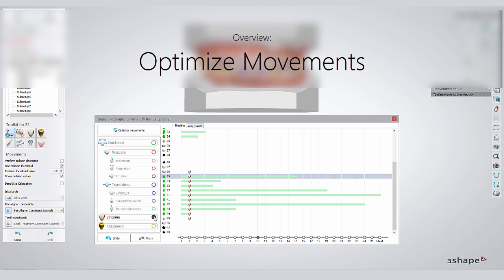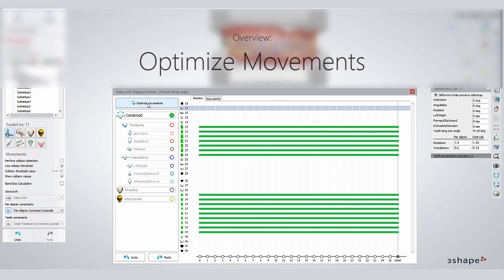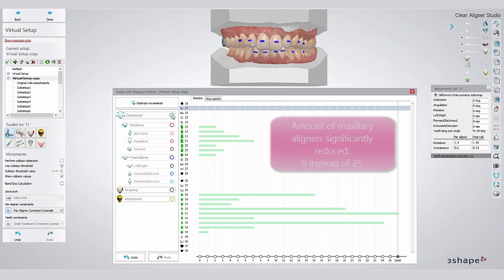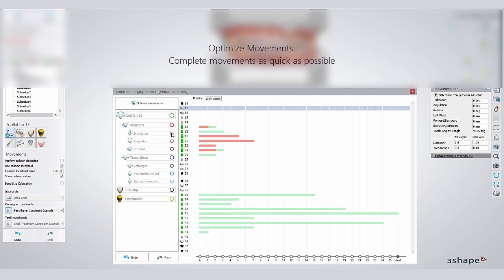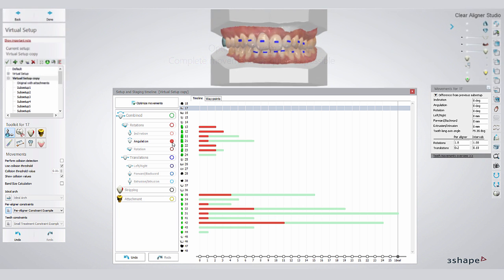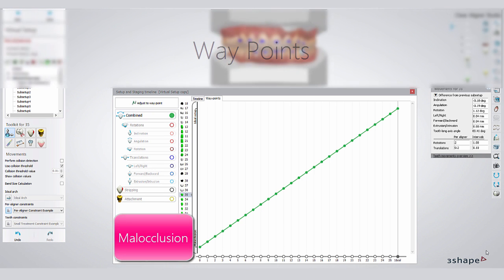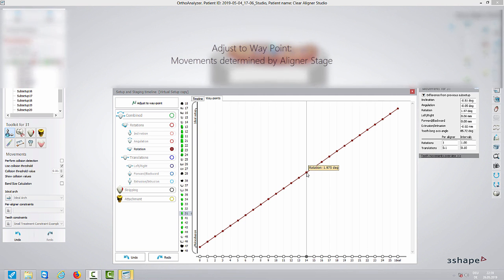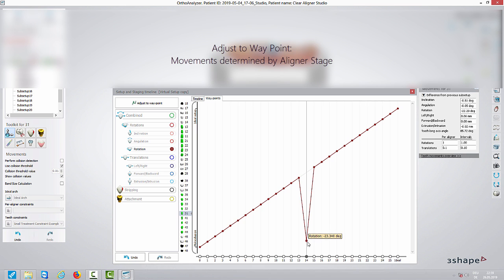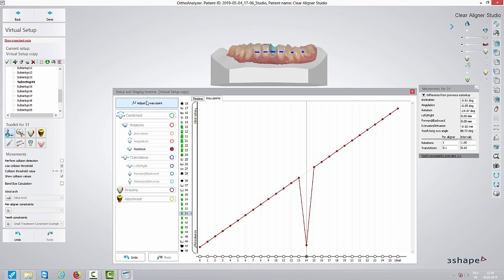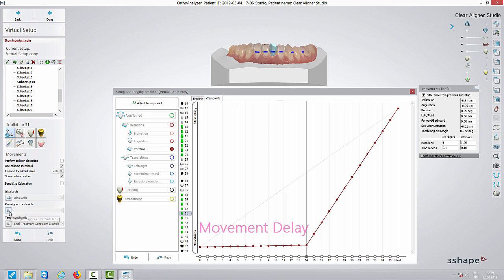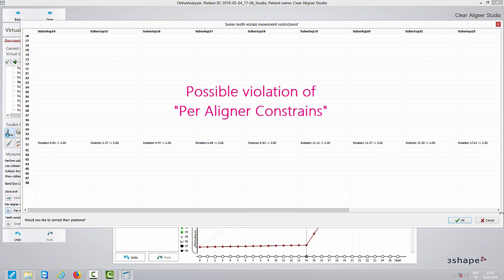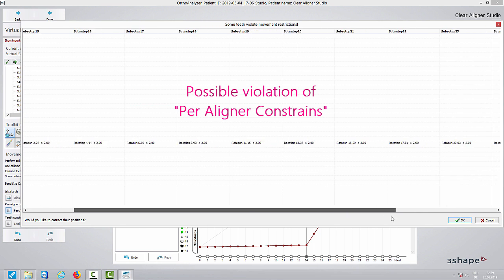Initially, the distribution of tooth movements is determined by the tooth which needs the most aligners to be moved into its desired position. Clicking on Optimize Movements may reduce the amount of aligners in one arch significantly. Basically, optimize movements means the software completes movements as quickly as possible. Waypoints show you the relationship between the ideal setup and the amount of aligners, and allow the user to select a specific aligner to delay or start a movement. This can be necessary where you have crowding and rotation — you want to create space first and then rotate the tooth. The check of a possible violation of the per-aligner constraints will show you if you have to add more aligners.